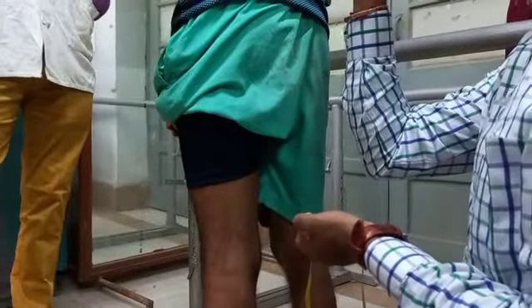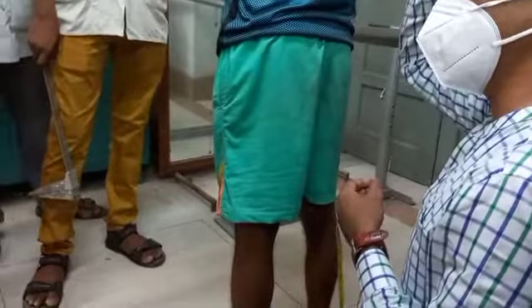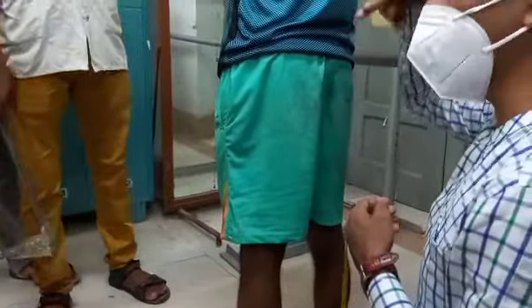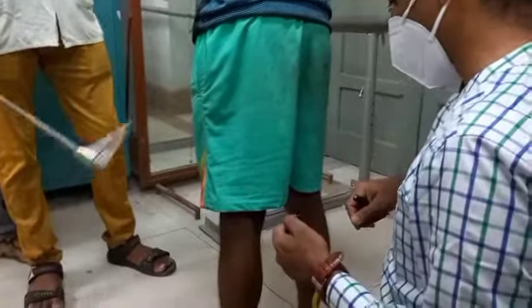What is that measurement? IT to knee. The IT to knee measurement is important because if the length of the stump is short, then you have to extend to the extent of the knee axis. But the knee joint also has some height, right? Your knee joint has a system. So you have to cut the system height from the IT. The upper portion of the system height you have to measure, and extend the plaster or get the socket extension done to that level.